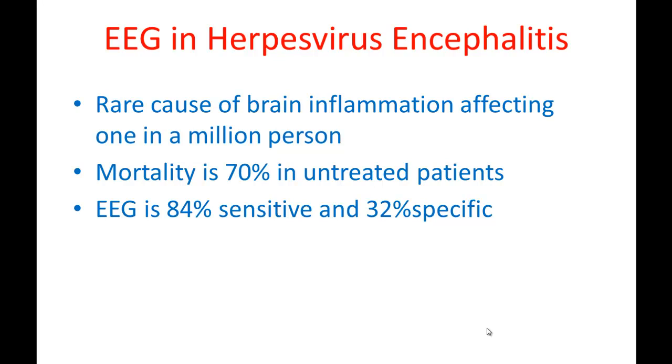EEG is a useful test in making a diagnosis of this condition. Of course, you don't make the diagnosis just based on an EEG. You have to take a good clinical history, examine the patient, and then use other investigations such as an EEG and an MRI to support your diagnosis.